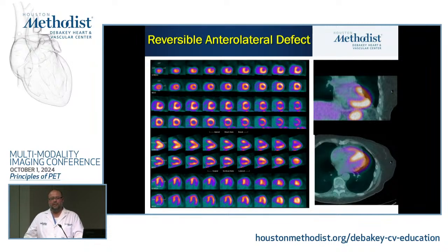So there were some publications saying this could happen in one-third, and initially when this used to happen, there was no other way other than repeating the images. Now we have a software tool where we can go back and just change it, but it has to happen on the machine. You cannot just work on the software and do that. You have to go back to the machine, talk to the techs, and tell them, I want you to re-register these. So there are tools to do that, but misregistration is one of the potential, correctable artifacts that you do not want to see on your studies.